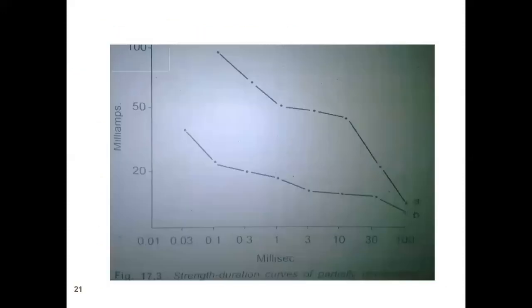As we can see in this graph, there are kinks, which show muscle fibers are partially denervated.